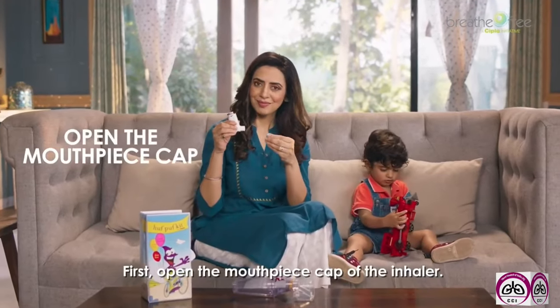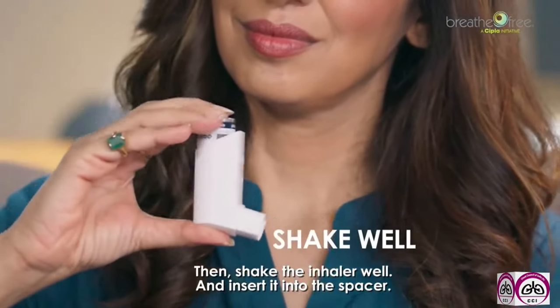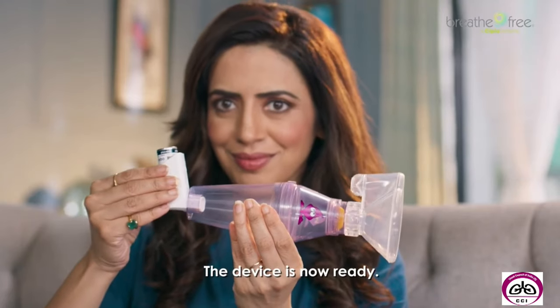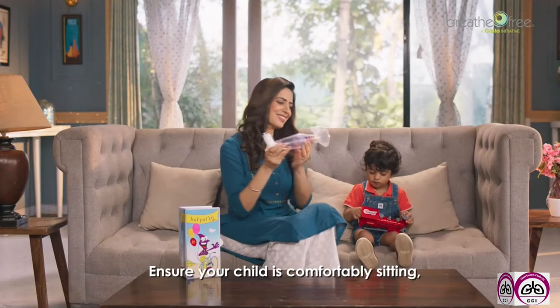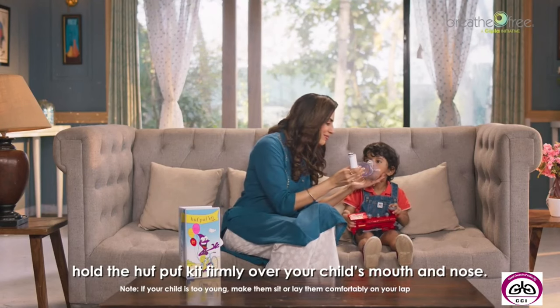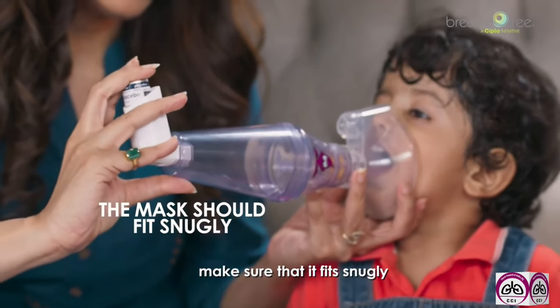First, open the mouthpiece cap of the inhaler. Then shake the inhaler well and insert it into the spacer. The device is now ready. Ensure your child is comfortably sitting. Hold the Huff Puff kit firmly over your child's mouth and nose. Make sure that it fits snugly.